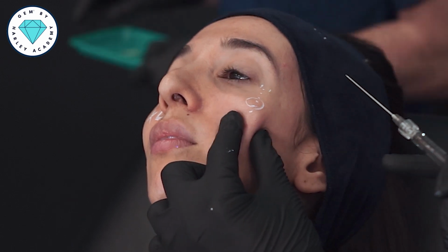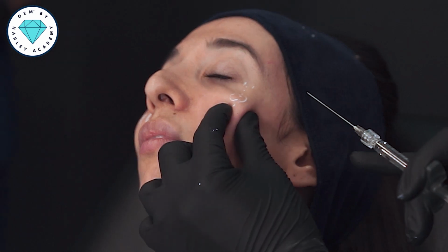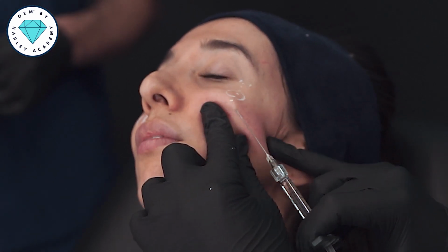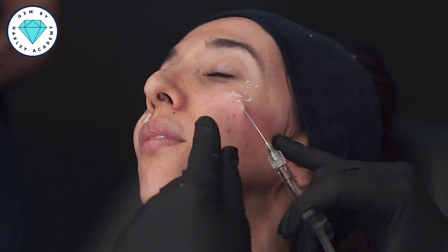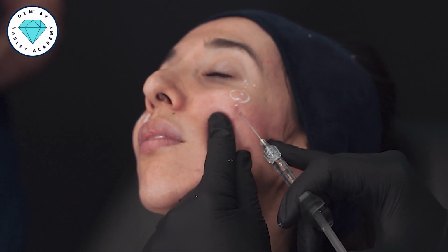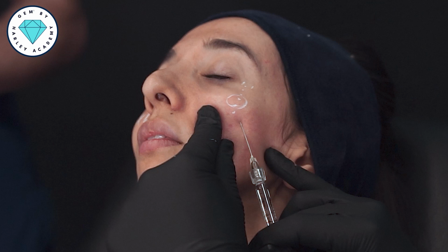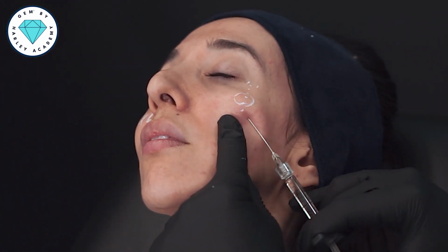And then let's go through the different layers that I'm targeting. So we're going to go through the dermis into the subcutaneous depth, okay? But we don't want to put the filler in this depth. This is too superficial. We need to move underneath the orbicularis oculi muscle. So a little push and a little pop. There. And now this is the depth that we can start to add some volume to create this new apex of the cheek.